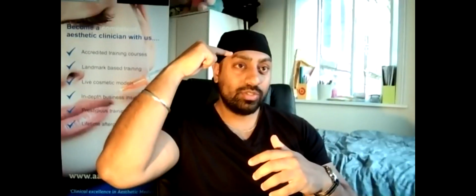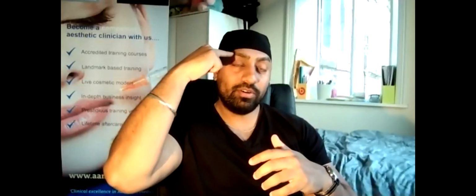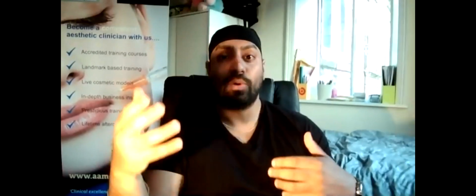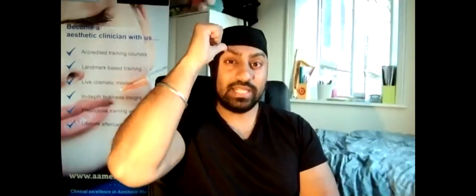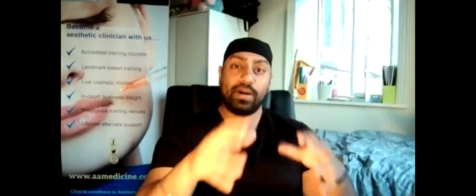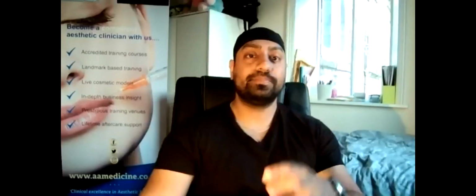What I would do is, just beneath the peak of my brow, go onto periosteum with a needle and inject something like 0.05 to 0.1. Once I'm done, I will hold the product and push it up, hold it there for about 10 seconds and then let go, and you will see a nice lift. If you combine that with injecting into the temples, you'll have an amazing result.